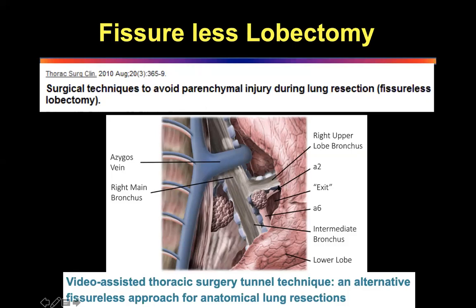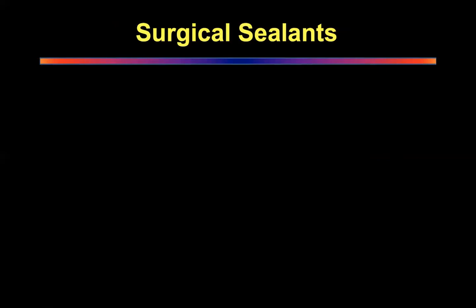Once the whole upper lobe is devascularized and cut away from the main structures, you then just put your stapler across like this and create the fissure with the staple line. This is a very nice technique to learn, and I would recommend all people who are doing lobectomies to learn to do this sort of lobectomy. It's a good technique and gives you good control of the vessels.